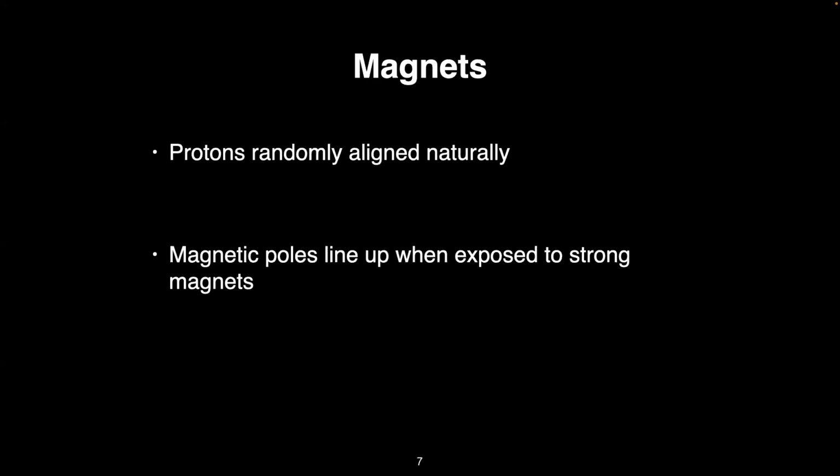And this is because of these properties that we mentioned before. They are like little magnets. So, those of us sitting in the room and maybe looking at this online, and hopefully you're not in a magnet at that time because then this won't be appropriate, in their natural state, not in an MR system, all these little magnets, the protons in our body, are randomly aligned.